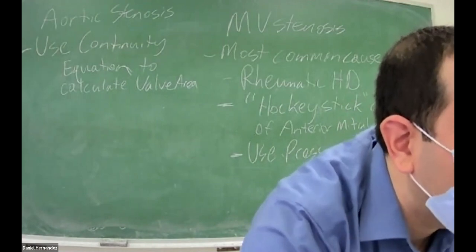Mark, what did I just do? Is the M mode pathology going to be on the final or boards?